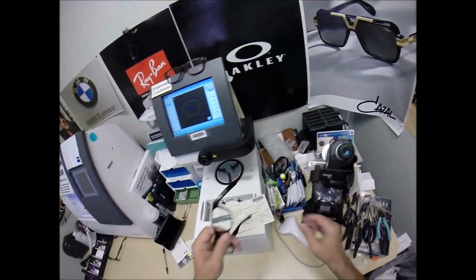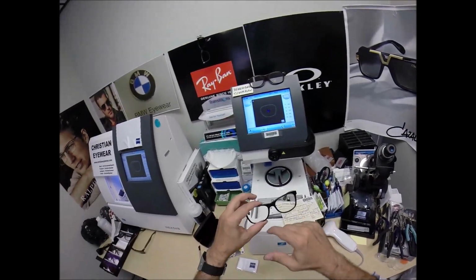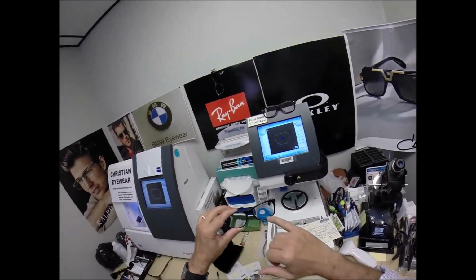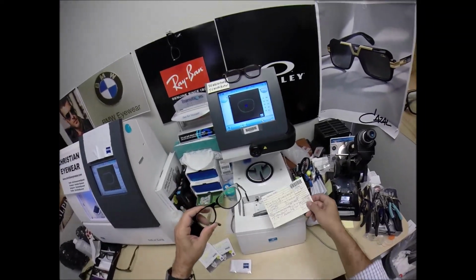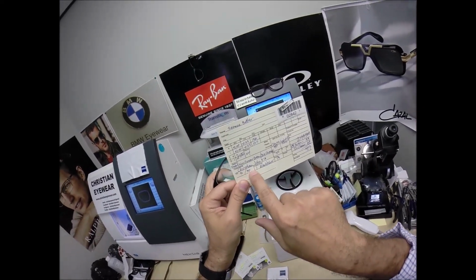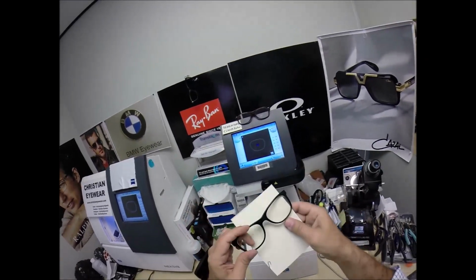Now, this is known as final inspection. I'm just inspecting to make sure the lenses are cut perfectly, that the optical centers, just like the crosshairs of a scope, are dead center in front of your crosshair, your pupil. I measure vertically and horizontally. So I want to go ahead and measure on the lens now. The PD, my pupillary distance for the right eye is 31, for the left is 30, for a total of 61. That's the horizontal. The vertical is 24 millimeters.